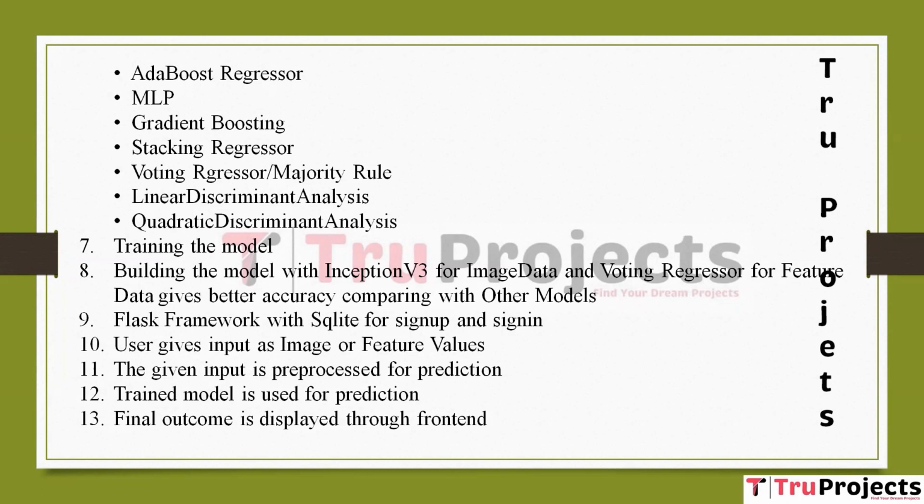Pre-processing user input for prediction. Once user input is received, it undergoes pre-processing to ensure it's in the correct format and aligns with the model's expectations. For images, this might involve resizing, normalization, and formatting. For feature values, it might involve data scaling and validation to ensure the input data is suitable for the model's prediction.